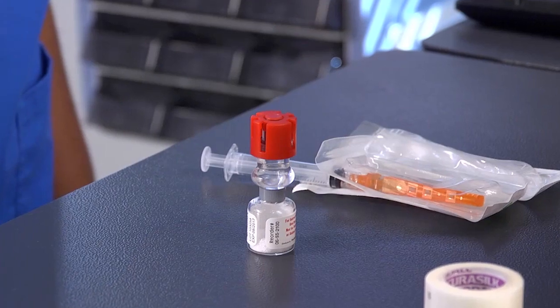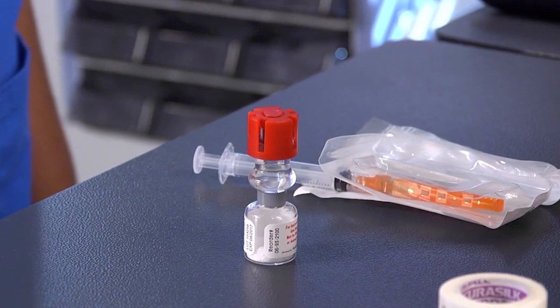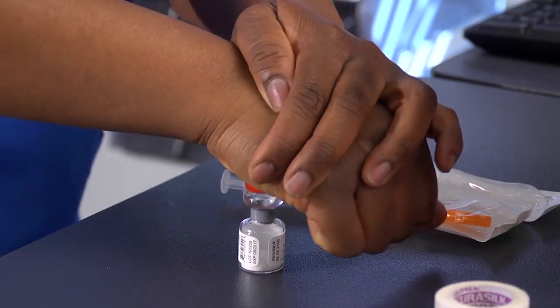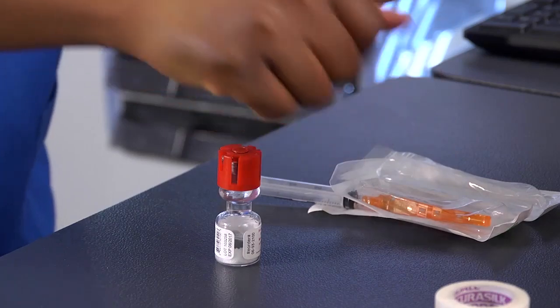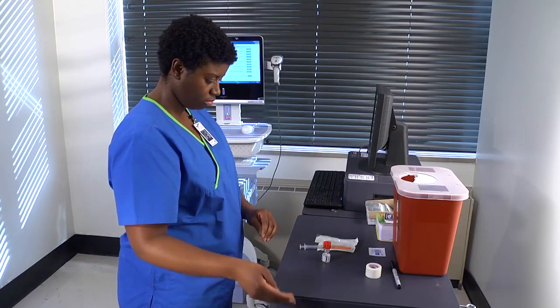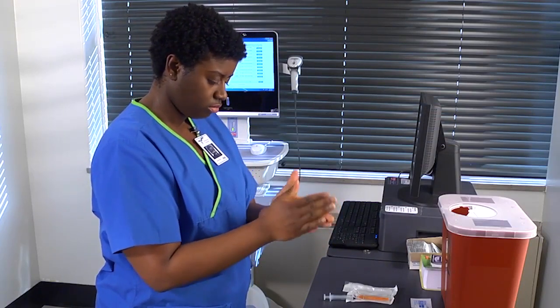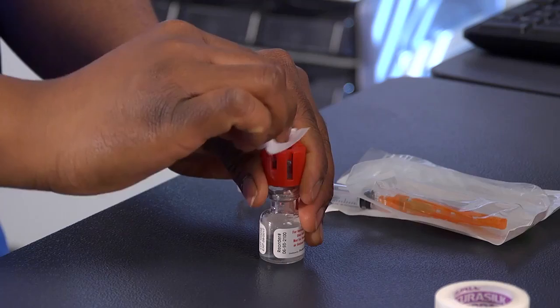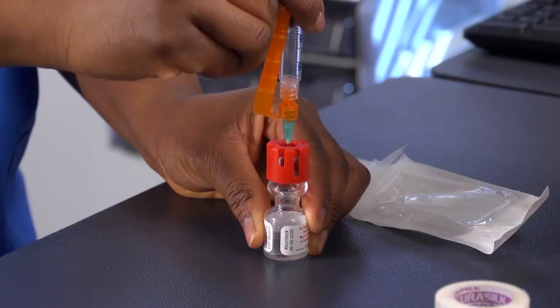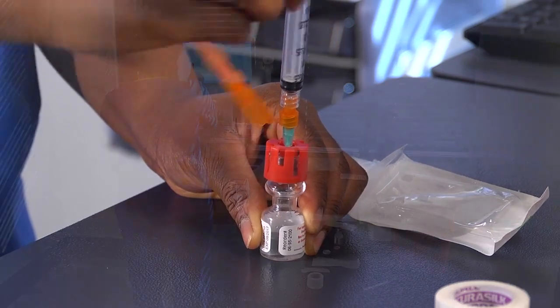Some medications are now available in vials that contain both the medication and diluent separated by a gasket. To combine, press down on the plastic activator to force the diluent into the lower compartment. Remove the top and gently agitate the vial to mix the solution. Swab the gasket with alcohol and then insert the needle through the center of the stopper. Invert the vial and withdraw the dose.